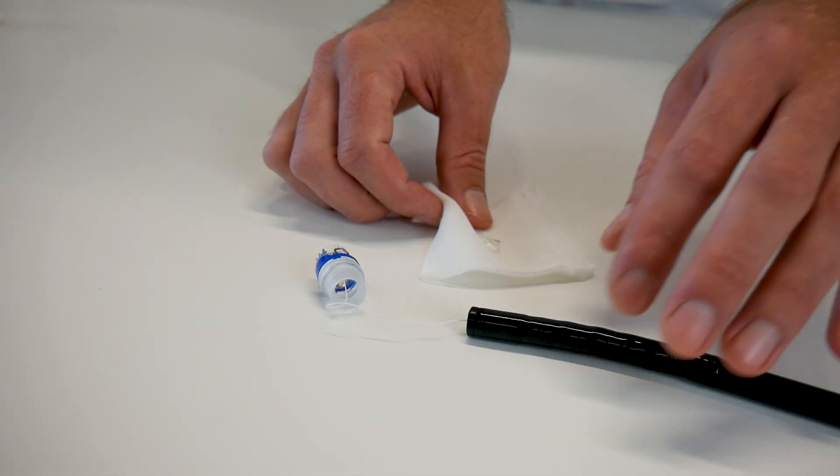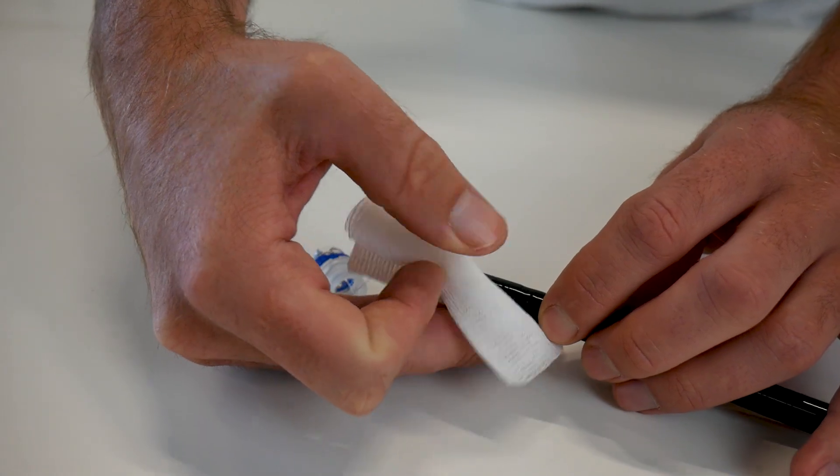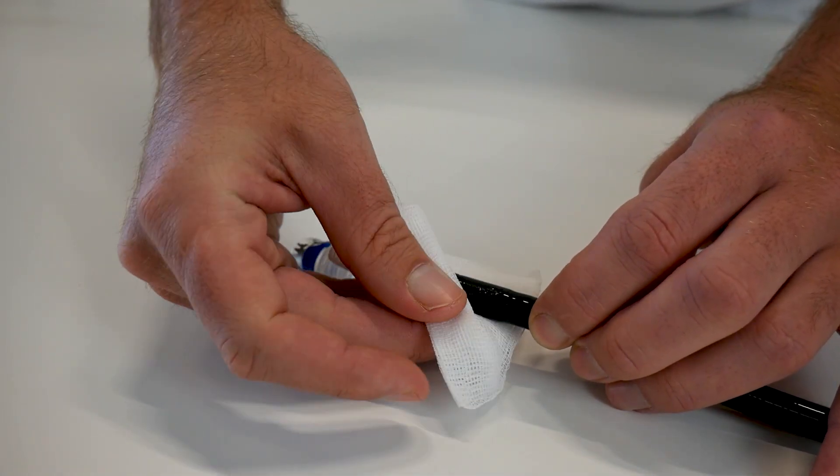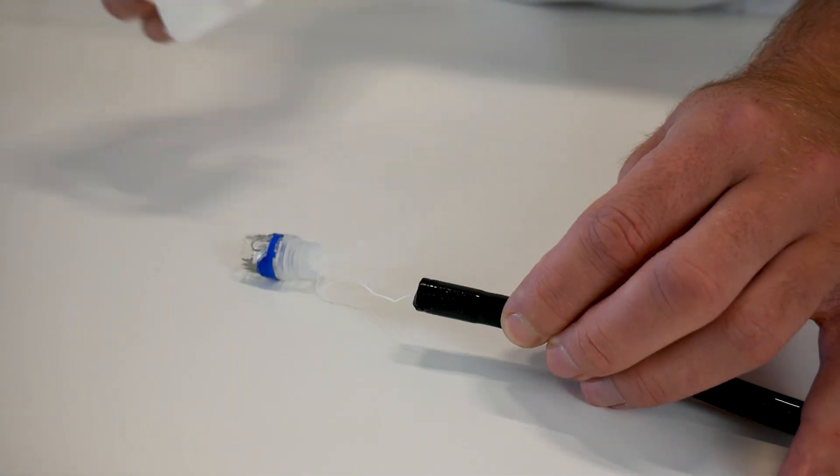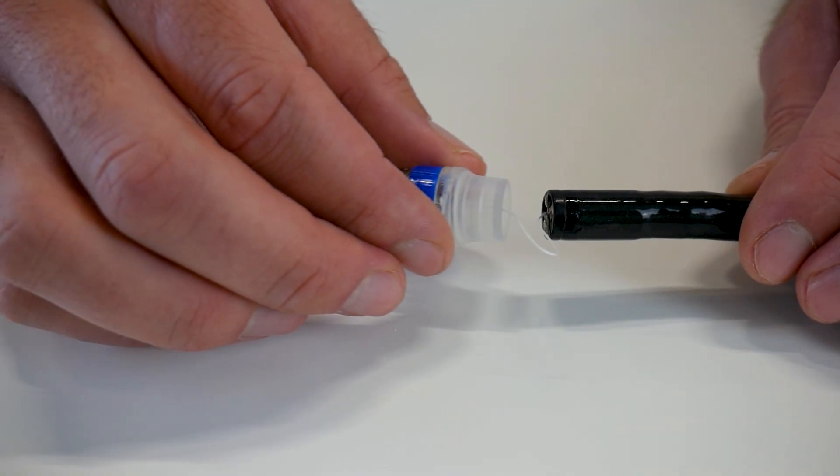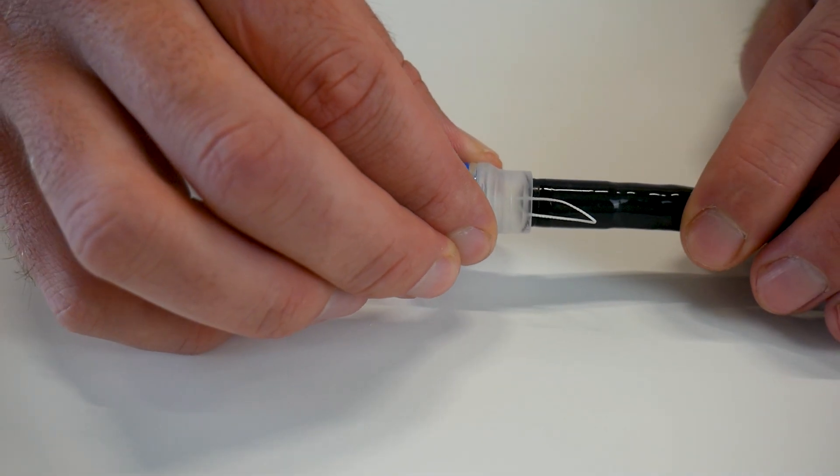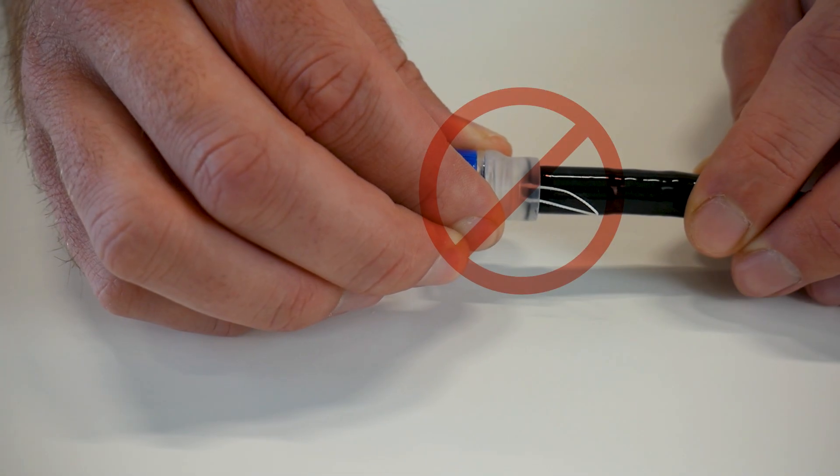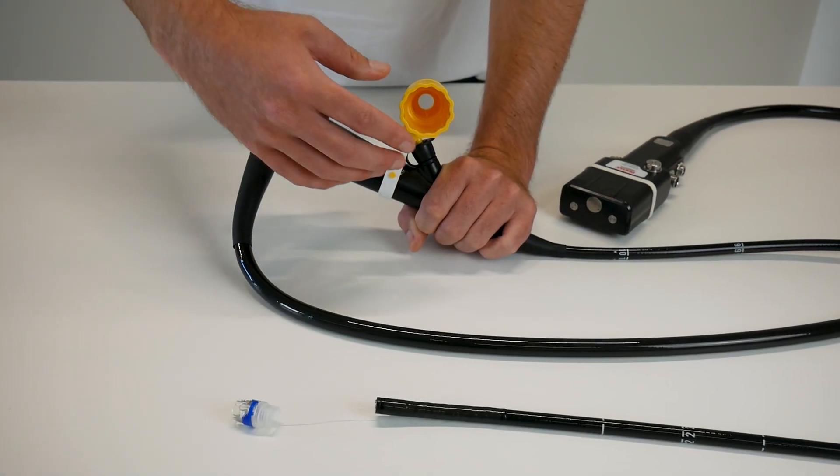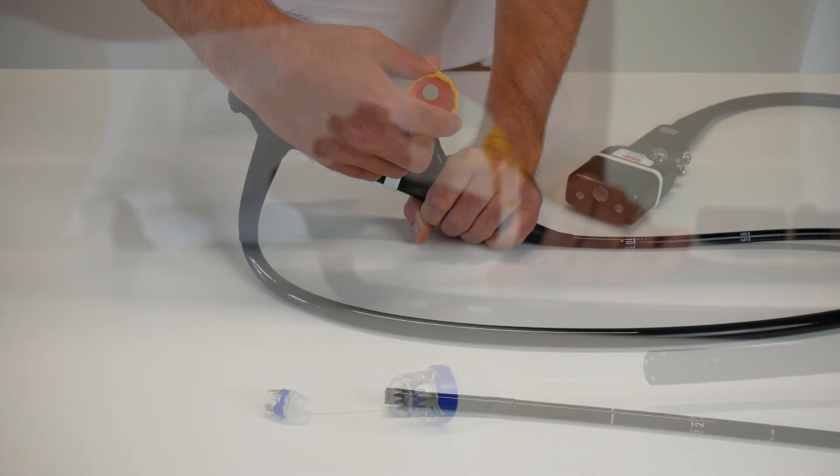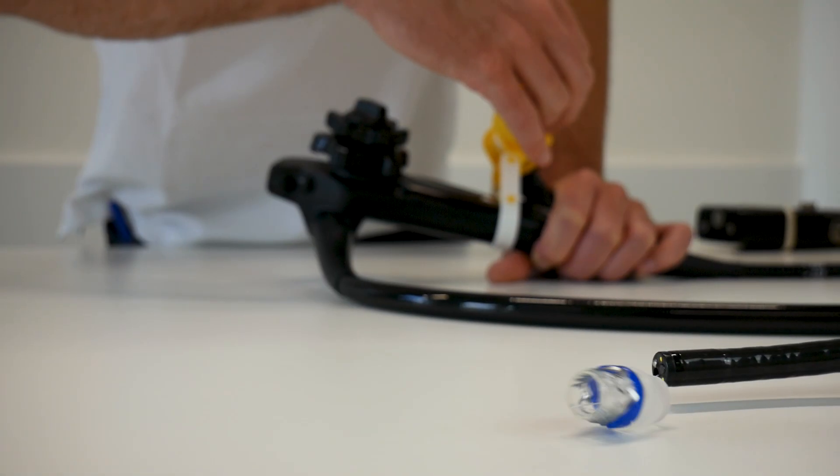Moisten the tip of the endoscope with water or endoscopic lubricant to facilitate assembling. Wind up the thread before placing the cap until the application cap touches the endoscope tip.